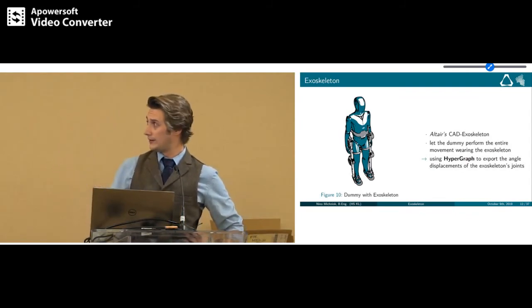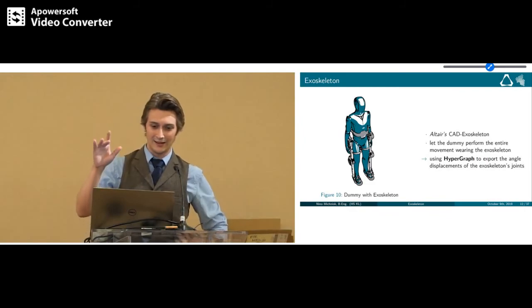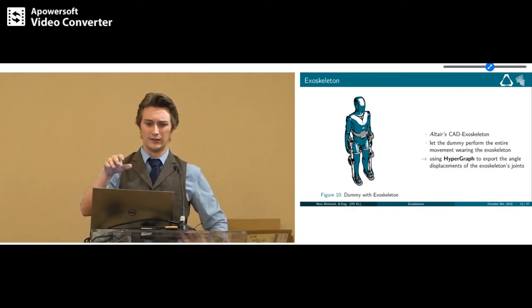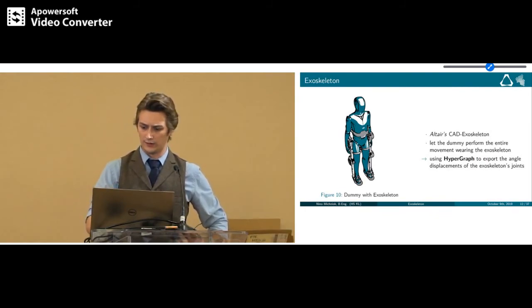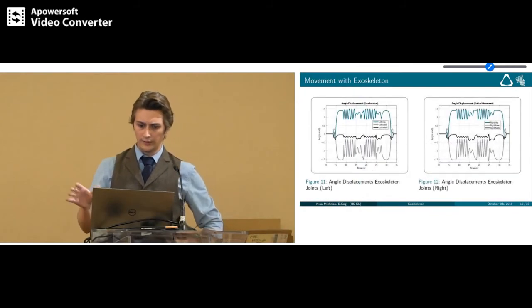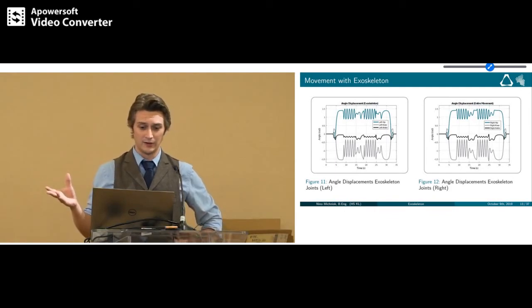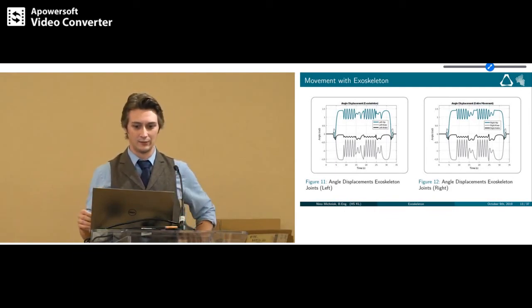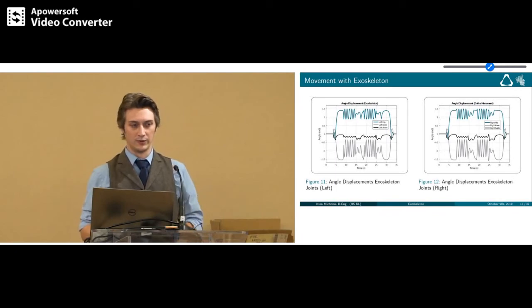This worked pretty fine. You can see them here. They look pretty similar to the first one I've shown you, but you gotta trust me on this, they aren't. And what I additionally did here is I've shortened the resting phases in between the single tasks to make the entire simulation a little bit faster. This worked pretty well. This was the first successful simulation of my exoskeleton performing the tasks like standing up, walking 10 steps, turning around, and returning to the initial position.